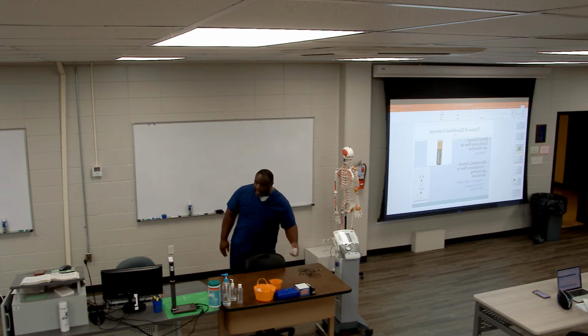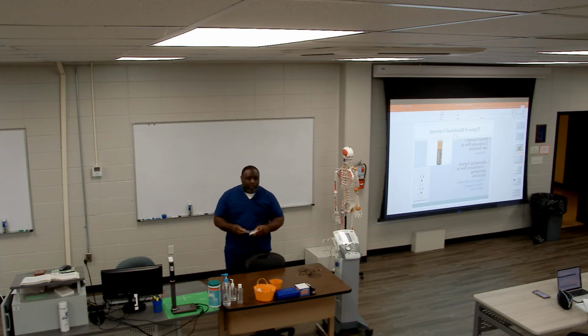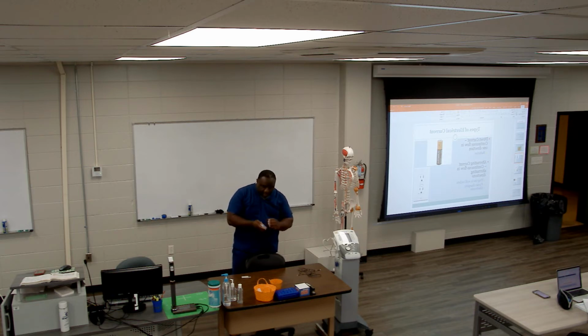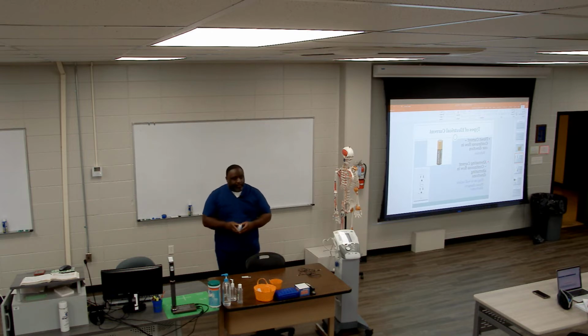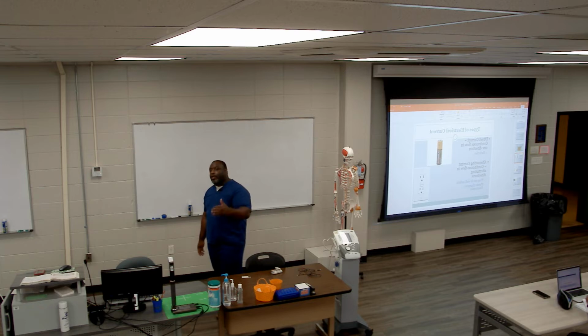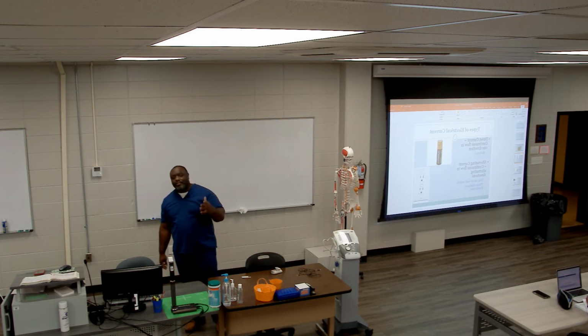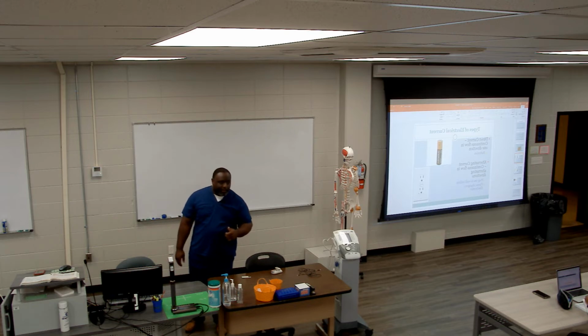Direct current is a continuous unidirectional flow of current that's delivered no matter what. Batteries are your best scenario for a direct current. They're going to continue to provide their current flow for as long as the device is in use.